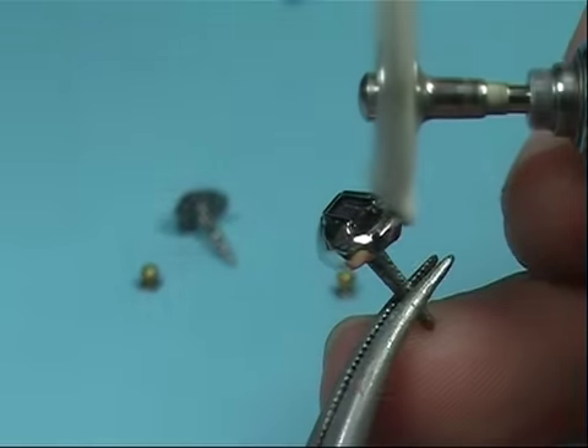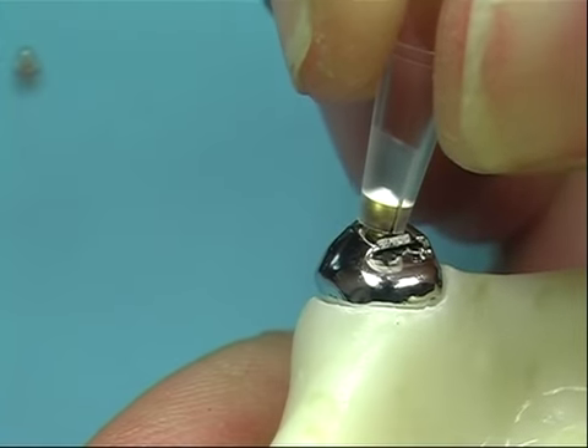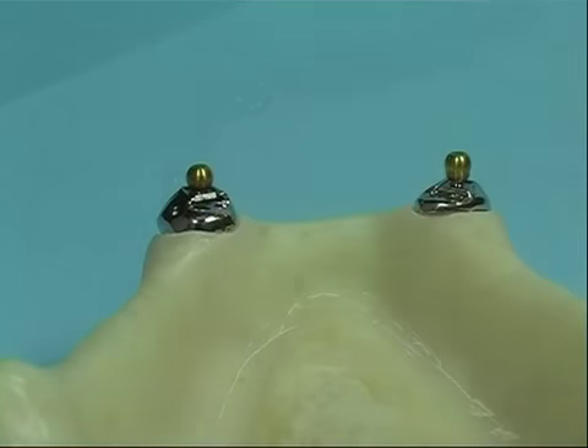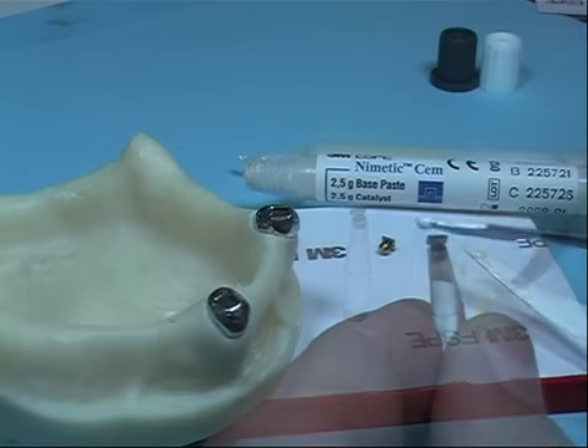Refine and polish any area of the cover to obtain better aesthetic results and promote good hygiene. Before cementing the sphere into the base on the cover, always remove any grease from surfaces. To glue the sphere, use a dual-part composite cement, non-light curing, or composite anaerobic cement.